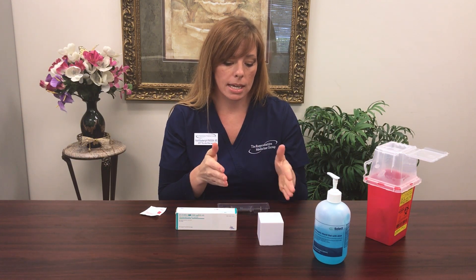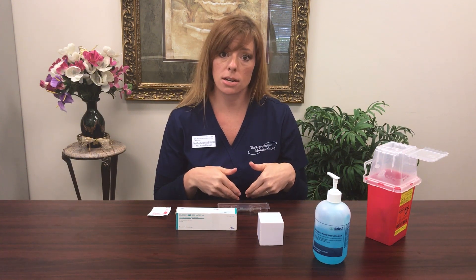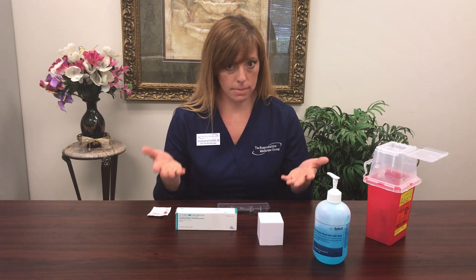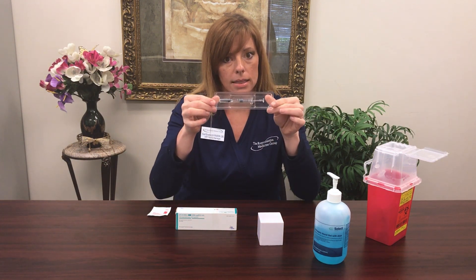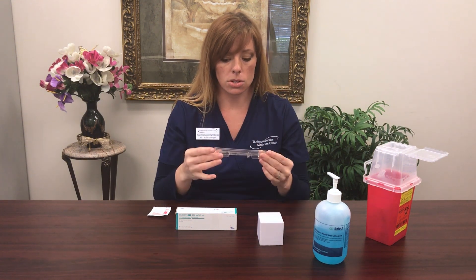Next, get out your alcohol swab so that you can prepare the skin. This is going to be a subcutaneous injection — we're using the fat in your belly. It's the only time in your life you enjoy having a muffin top, so Merry Christmas — that's our gift to you. Then take the shot out of the box. It's going to look like a clear, packaged, sealed syringe.